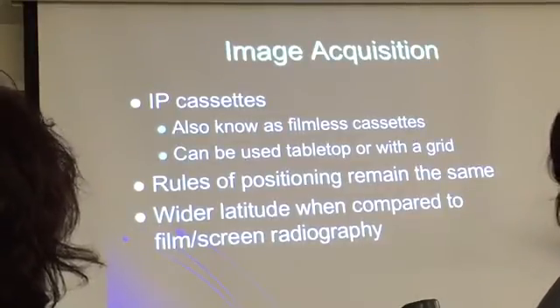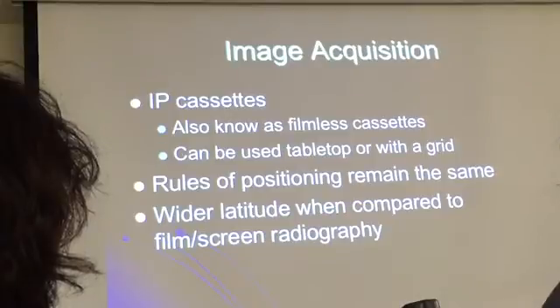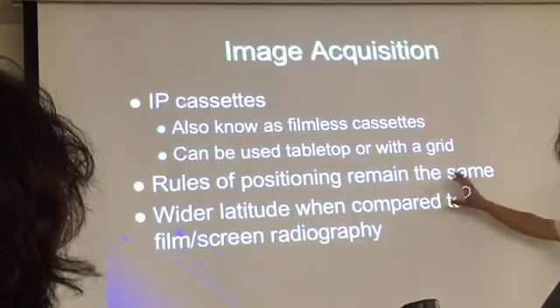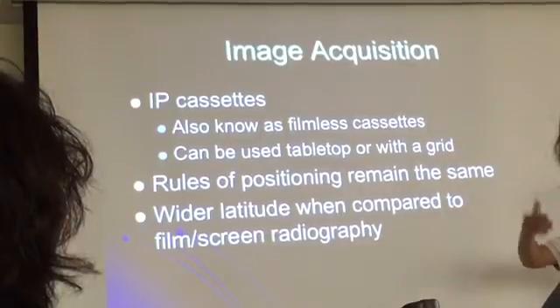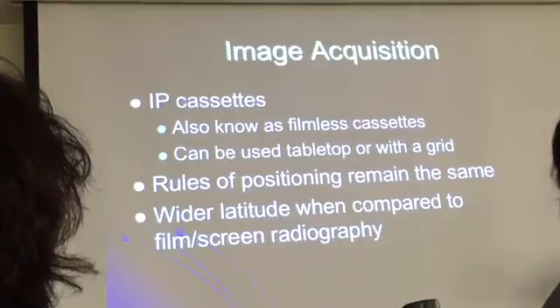If I go back 6-7 years in our program, you should have seen it, it was crazy, because that was the time when our hospitals were changing to digital systems, and some of the techs were using some really crazy techniques, especially those that went straight into DR. So I think it was easier for techs with CR because everything pretty much remained the same. You still have to be careful about techniques, but everything else was the same, and so this helped a lot.